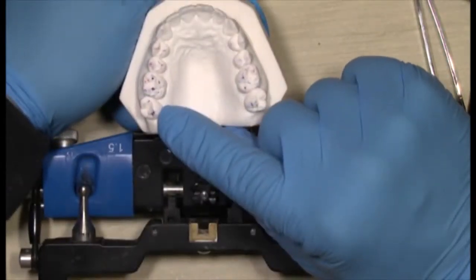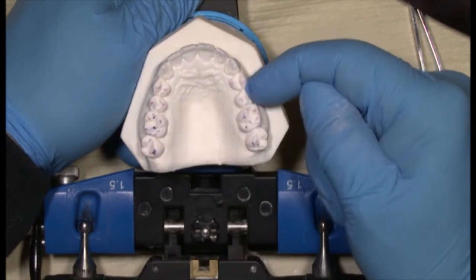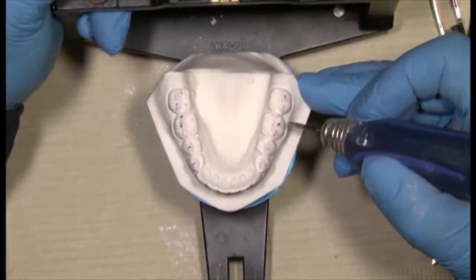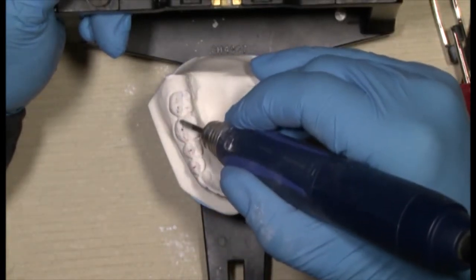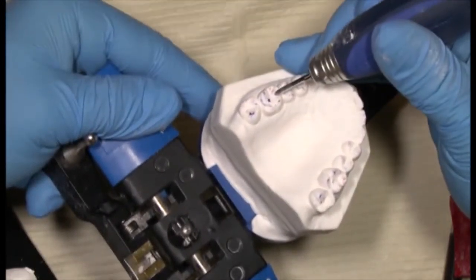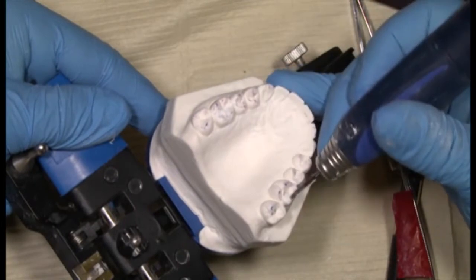At this point, you can start to see the marks very clearly. Second molar, first molar, starting to move up. This bicuspid, we don't have these two bicuspids in contact, nor do we have the cuspids. So we're getting close. If we go to the bottom, these are on the cusp tips. I'll take the central fossas away. So at this point, it would be these central fossas deepen. Any inclines will come away.